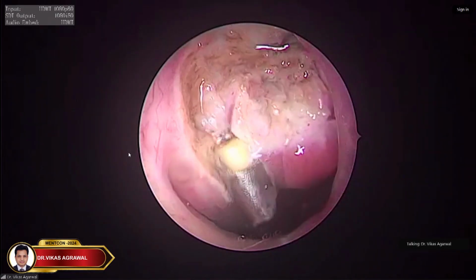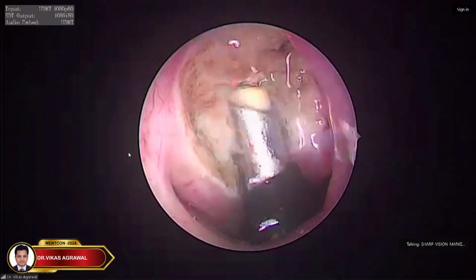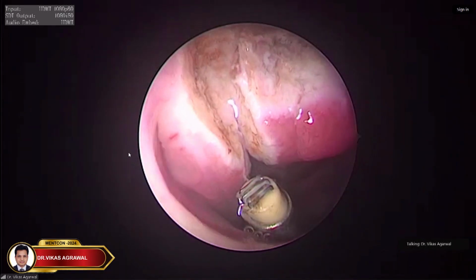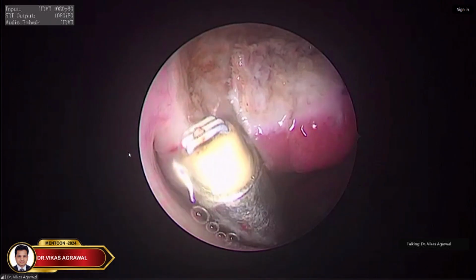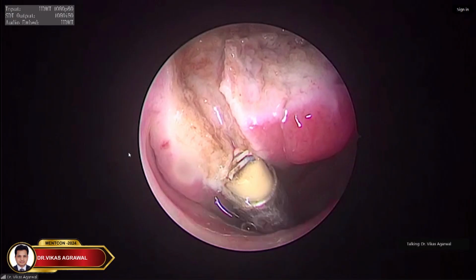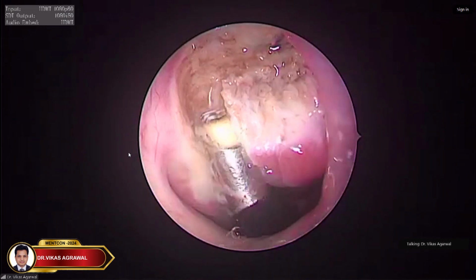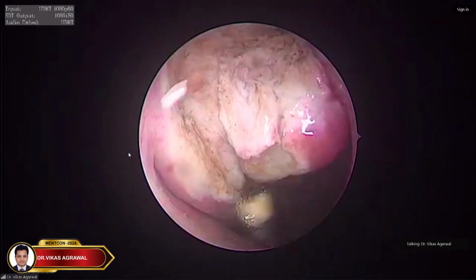All right? Okay. This is the lateral boundary. If you miss that lymphoid tissue, is there a greater chance of recurrence or blockage? Absolutely. Therefore, if you remove it, I am going till almost, you can see, 4 to 5 millimeters from the eustachian tube orifice, but I am only submucosal. I am not getting into the muscle. If you get into the muscle, you will create fibrosis, which obviously you do not want. Right? And now let me debulk.